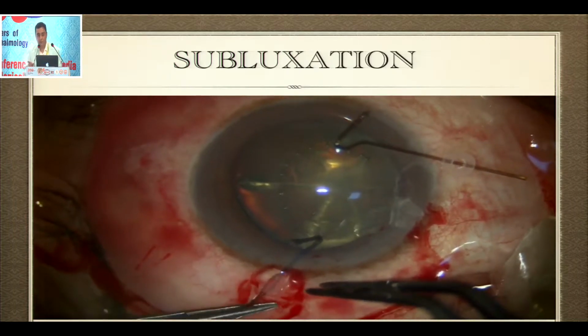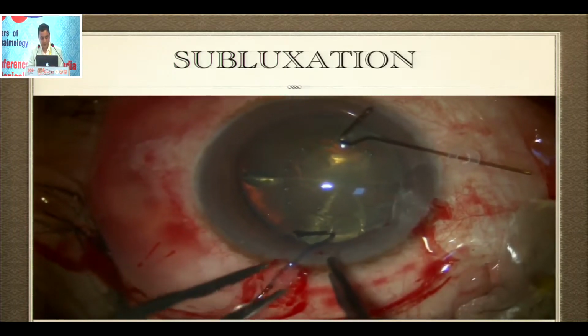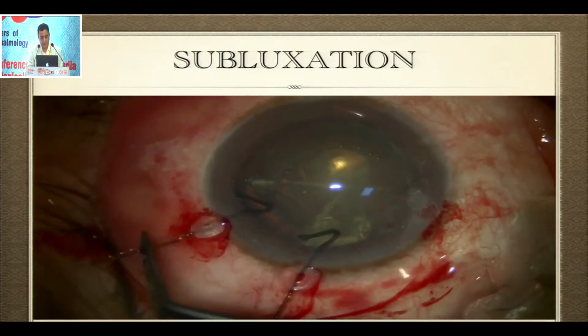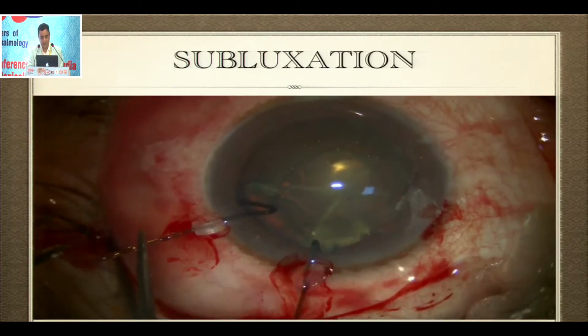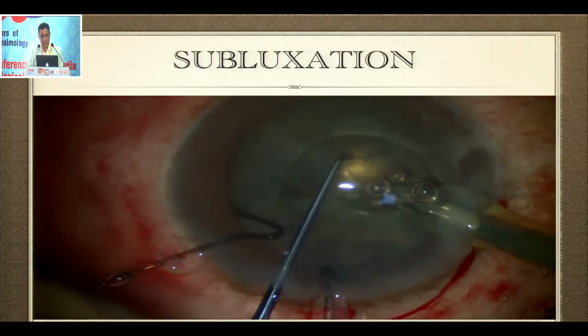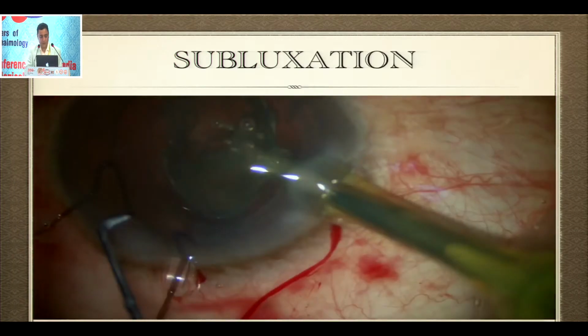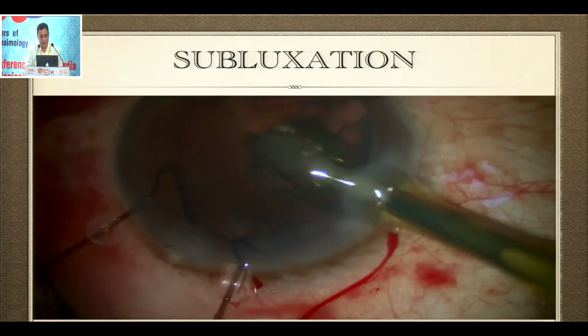I'm going ahead and then just making my incision, pinch the rhexis out, give support to that area of subluxation with capsular hooks. Okay? So these are capsular hooks which you can see going into position. Once that is done, I go ahead and do my fragmentation. So this case, I'm going ahead and doing phaco. I got my support onto the capsular hook, nothing to worry. Doing my phacoemulsification and then doing IA.